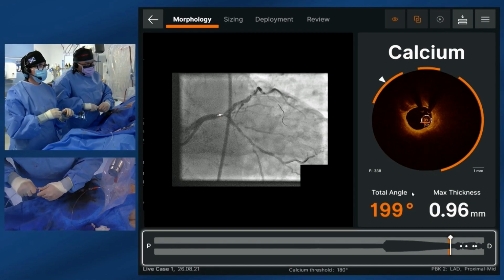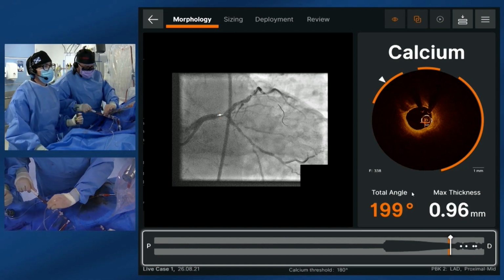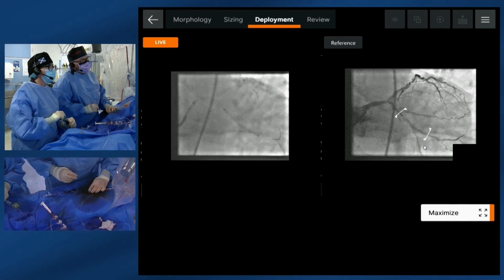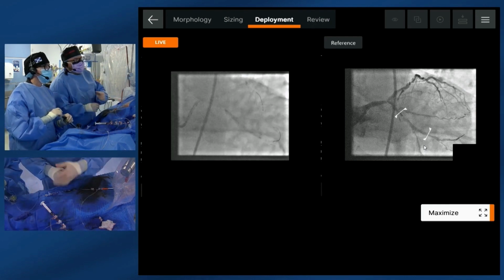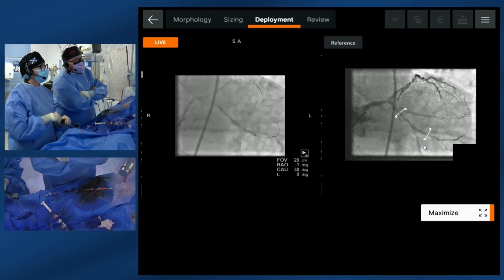Yeah. Okay, so after the non-compliant balloon, the long stent, that's a 38mm Zion, so it actually tracked very easily. So that's our 2.5 stent going up. That's okay. Take that to 14 atmospheres. And it looks actually a good size distally, doesn't it? It does. And the expansion's not bad.